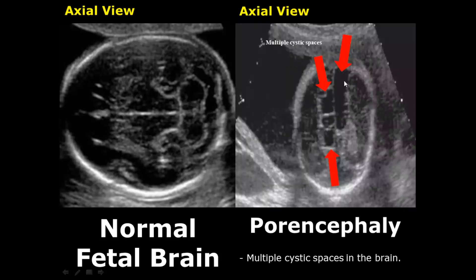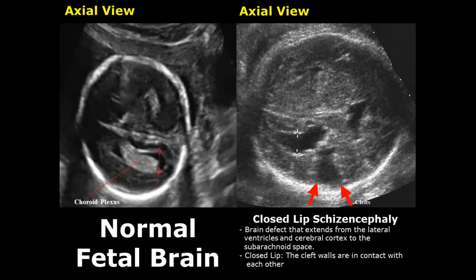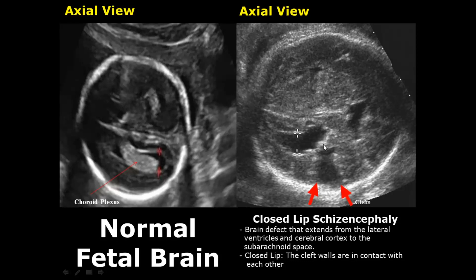Porencephaly is defined as multiple cystic spaces inside the brain — here we can see four separate cystic spaces. Schizencephaly presents as clefts inside the brain, mainly of two types: open lip and closed lip. These clefts extend from the lateral ventricles all the way to the subarachnoid space, reaching the skull bones. In closed-lip schizencephaly, the walls of the cleft are in contact with each other, meaning there is no open connection between the lateral ventricle and the subarachnoid space.